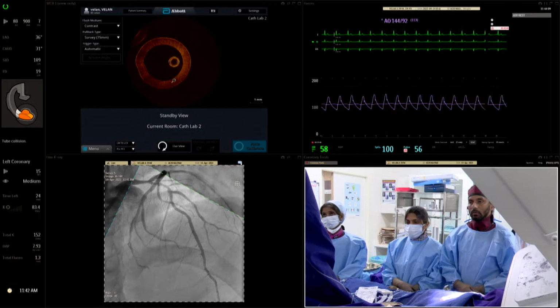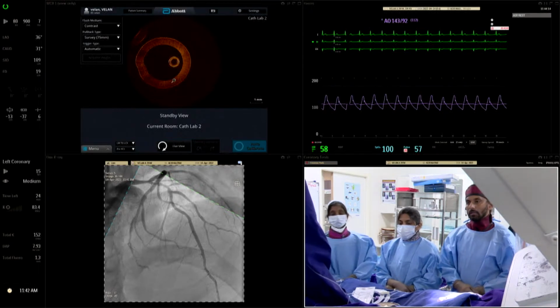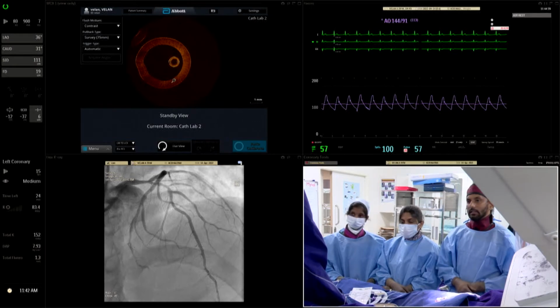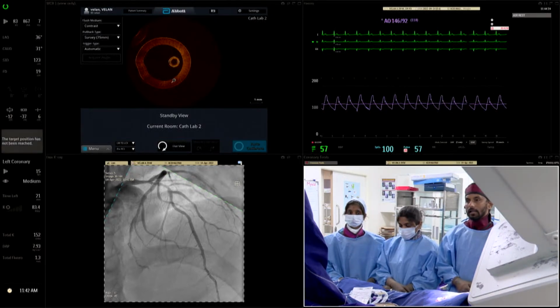An initial plan was for me to do the stenting from the distal to the septal branch. But looking at the images now with the RAO cranial and the PA cranial, with the guiding catheter and good injections, I can see that the atheroma below the septal branch is not that significant.